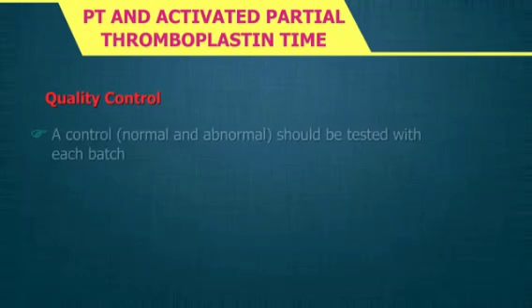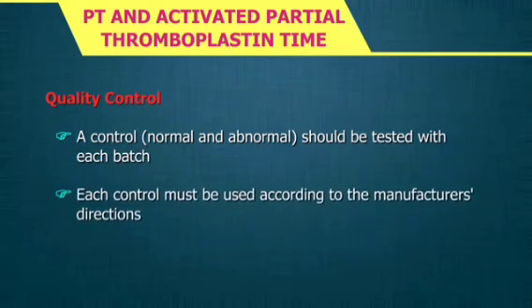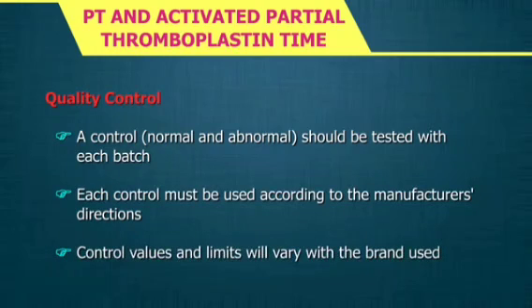Quality control. A control, normal and abnormal, should be tested with each batch. Each control must be used according to the manufacturer's directions. Control values and limits will vary with the brand used.